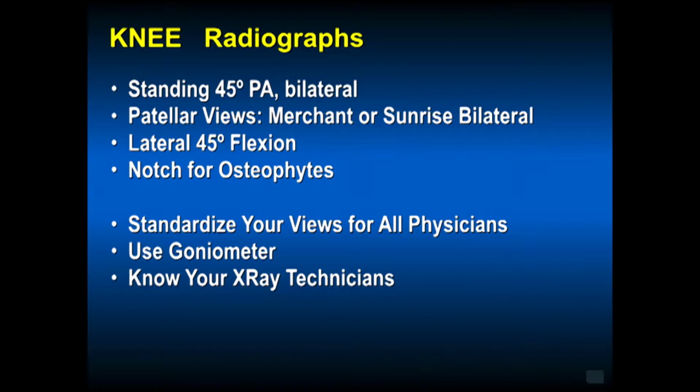Notch views are done for osteophytes. The classic notch view is with patients up on all fours. Some people use the Rosenberg view of a 45-degree PA view as their notch view. So if you're looking to measure notches for width, as in ACL injuries or osteoarthritis, you need to make sure that the views are standardized and are comparable center to center or day to day.